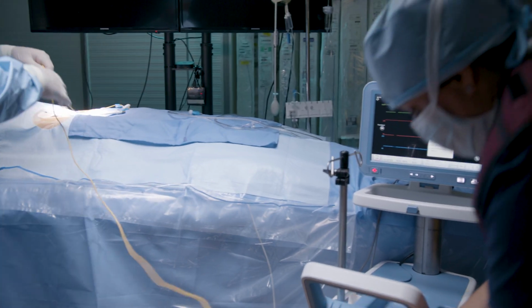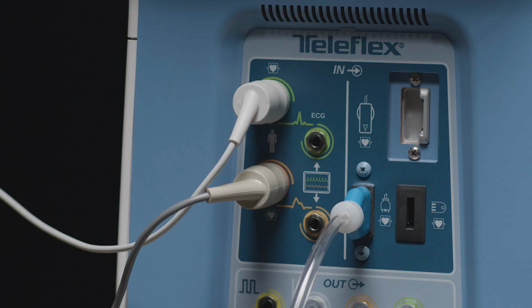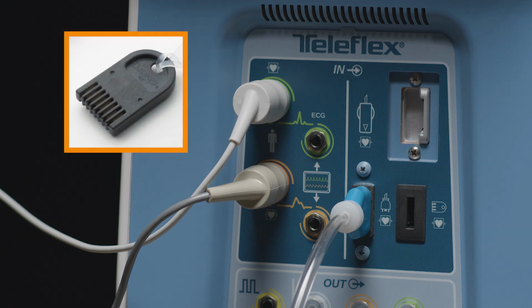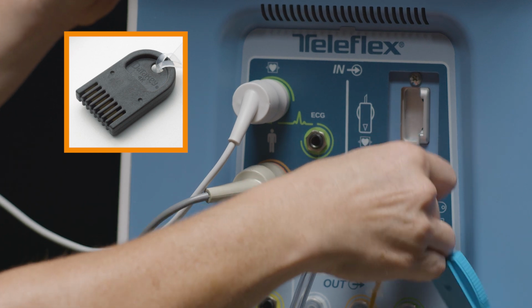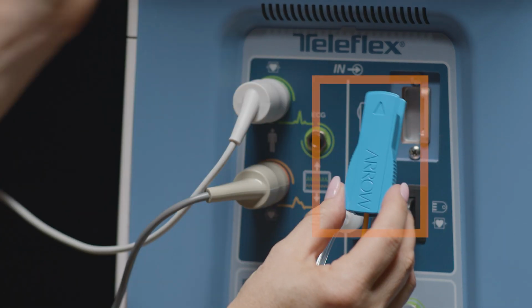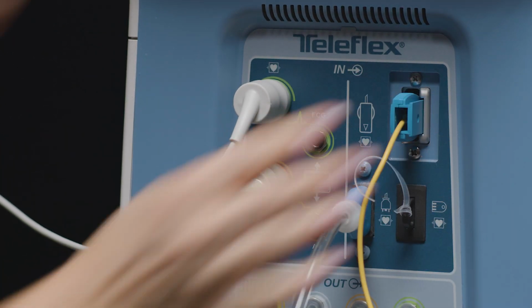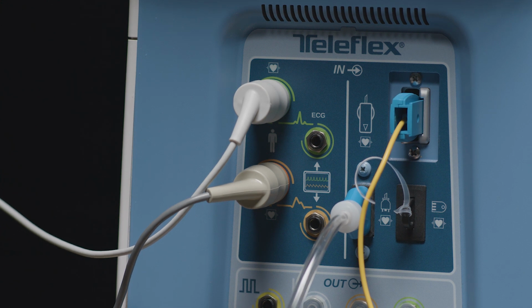There are two connections that must be made prior to zeroing the fiber optic sensor: the black CAL key and the fiber optic sensor. Connect the CAL key first to the CAL key connection. Connect the fiber optic slider into the fiber optic connection. The slider will only fit one way and goes in with the arrow logo facing left. Push the blue slider gently into the opening until it clicks and you hear a 2-beep tone.